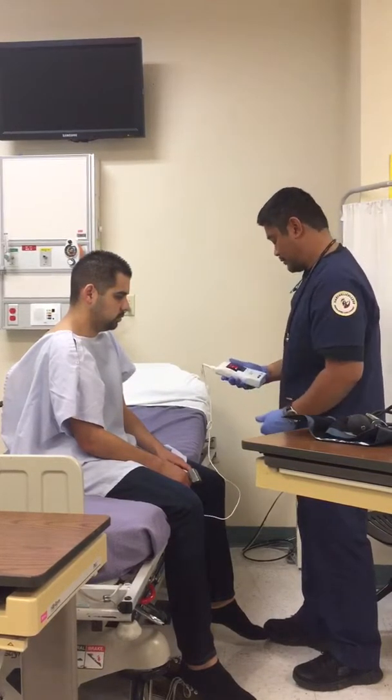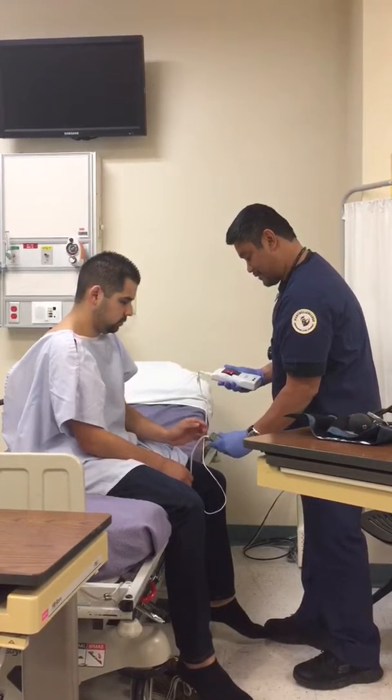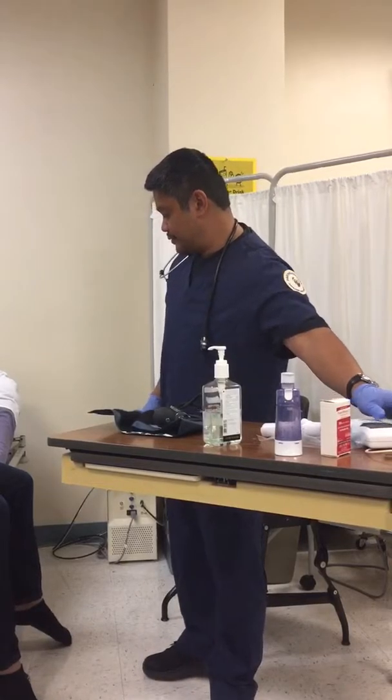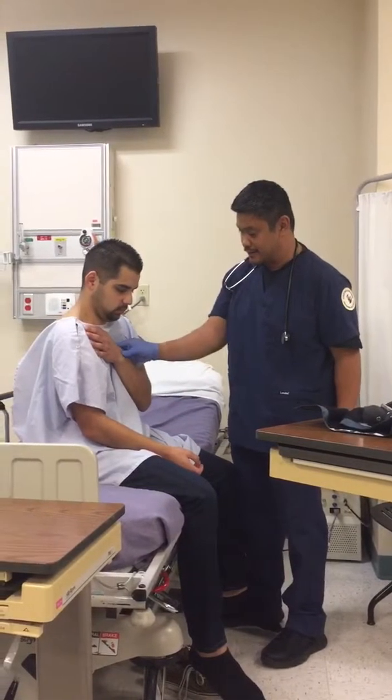So I got a saturation level of about 97%. That's pretty good. And I'll take your pulse, so please put your arms across your chest right over here. That's okay, good. Thank you, appreciate it.